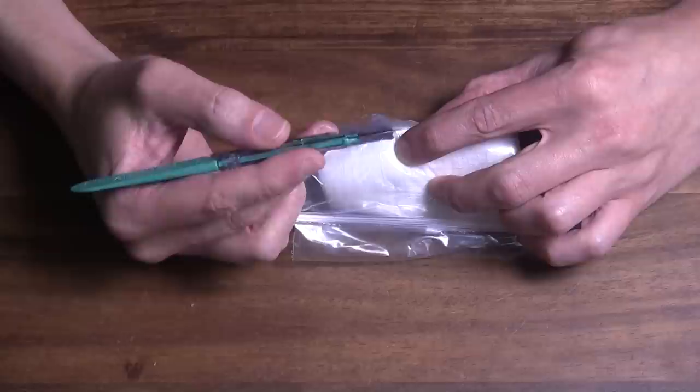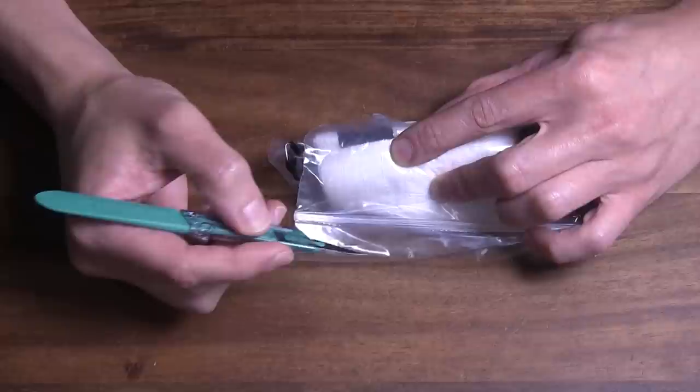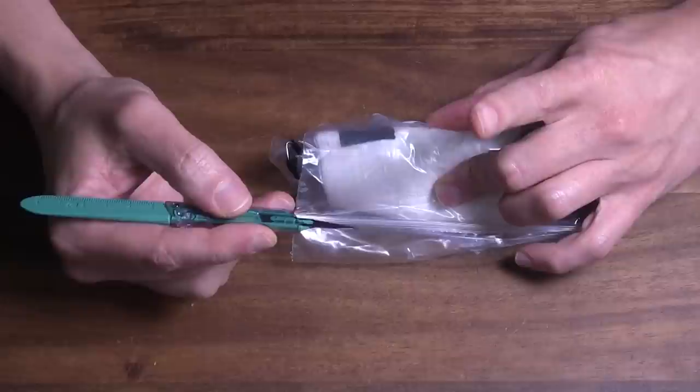And what I'm going to do now, and what is different than my previous iterations of describing this technique is anytime the scalpel is going to go into the field, the finger points up. Anytime the scalpel is going to go into the field, the finger points to the ceiling. So it is nowhere near the scalpel. The scalpel and the finger never coexist in the same space.